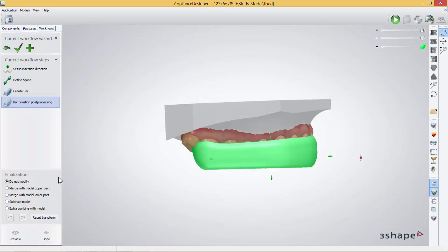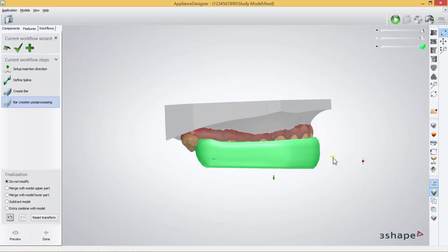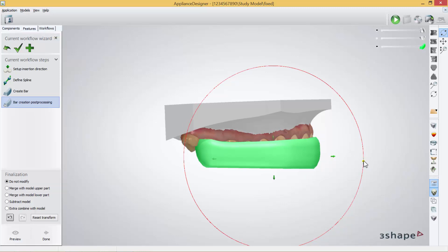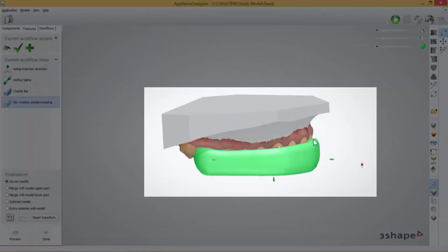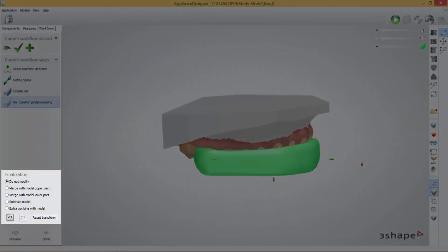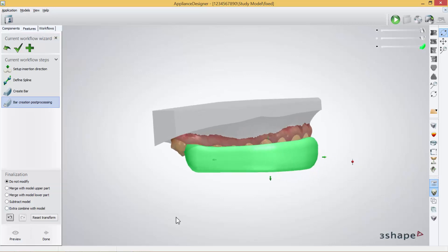Press Next. In this part, Bar Creation Post Processing, it's possible to move the bar around using the arrows or the points here. Also in the left corner you can see Finalization. The first one is Do Not Modify. The second one you can merge the model with the upper part — this will take all the undercuts from the model from the bar. You can merge with the lower part or you can subtract the model from the bar as well. Extra combined does not work in this feature. Just press Done. Once you've chosen one of the options, then your bar is finished.